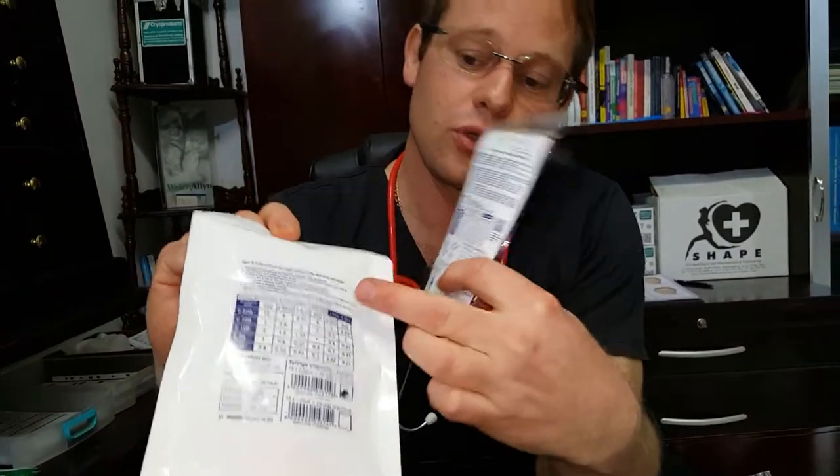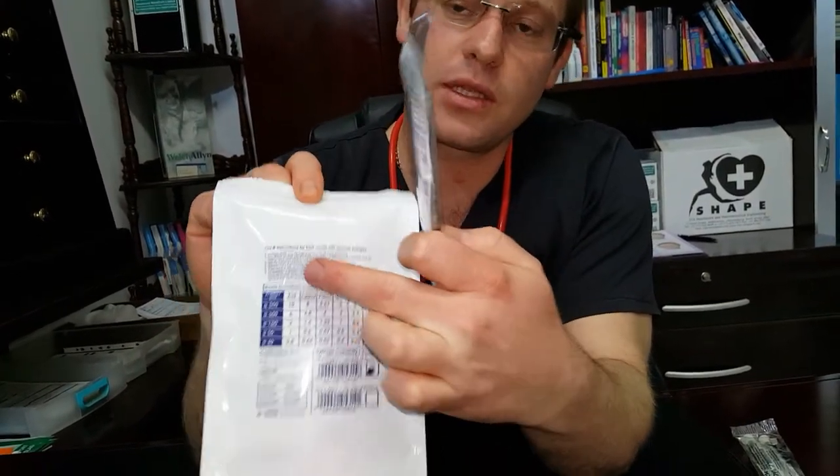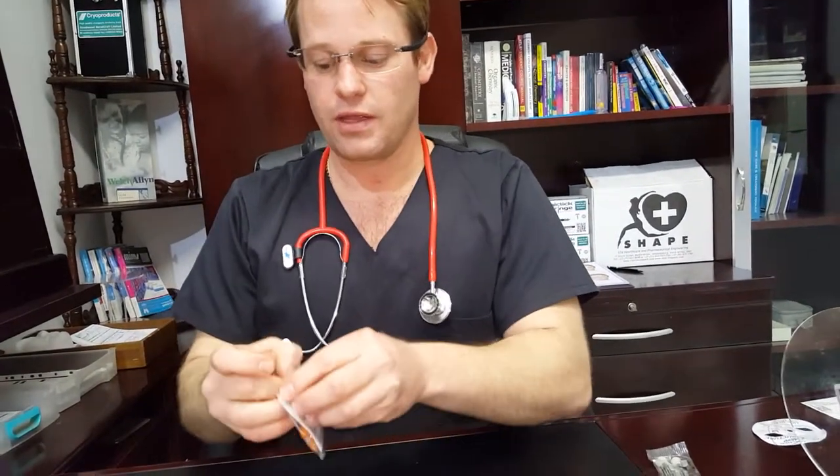The 3 pack has its instructions at the back, like the 15 pack does. It basically informs you that every click dispensed gives you so many units depending on the dose strength of your product. You can follow those guidelines — just follow the instructions.